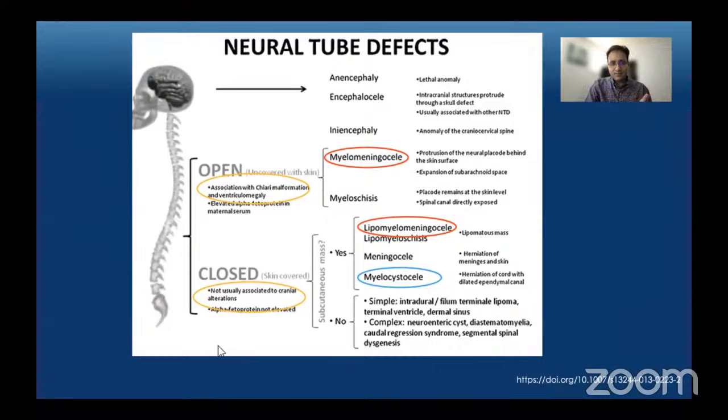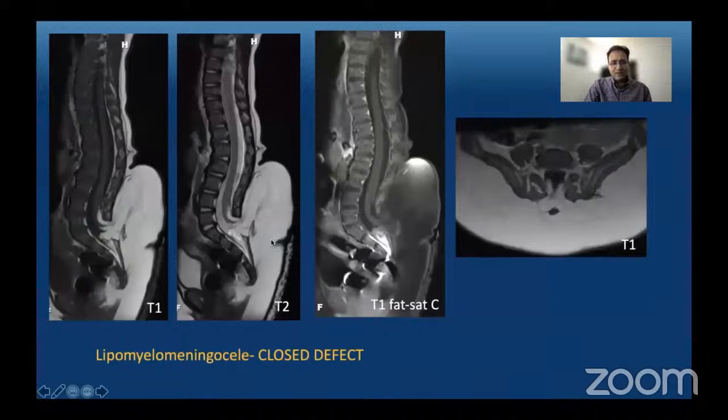This is an example of lipomyelomeningocele where there is no cystic structure but rather a lipoma contiguous along the distal spinal cord and continuous with the subcutaneous fat. Again, this is a skin-covered defect.